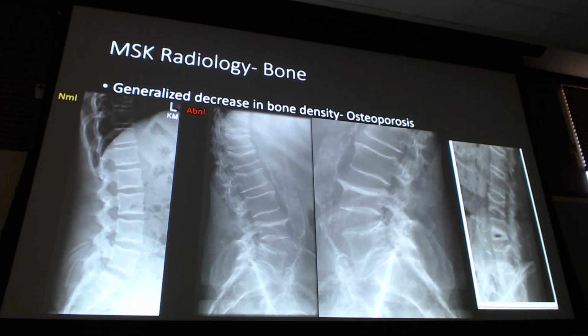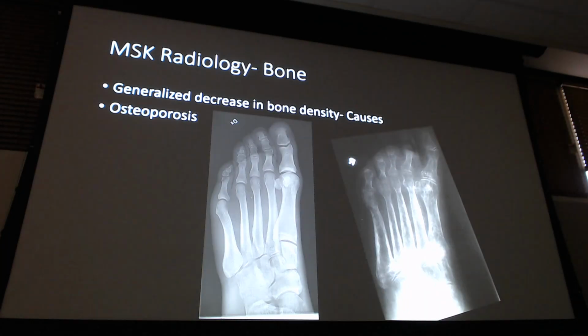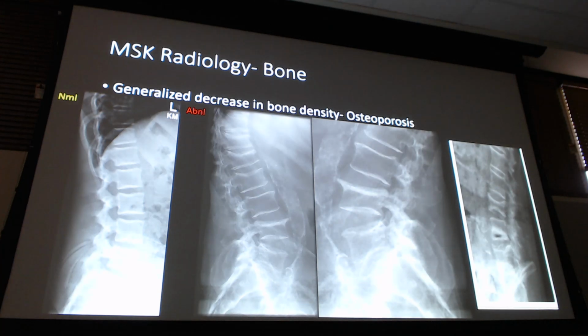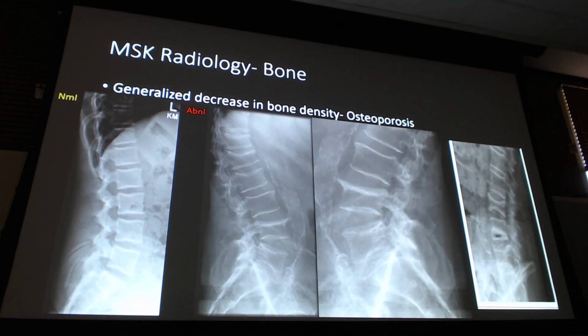So when I shoot an x-ray on a foot, I have a very thin area to go through, right? So that cortex and stuff is gonna pop a little bit more compared to that medullary canal, because I have just this thin area of a foot to put the radiation into. When I do a lateral spine x-ray, I'm pumping radiation through all of this tissue. So more of that radiation is getting dispersed, more of that is getting absorbed, so you don't have as bright of a contrast in there because of the spine. Okay, so good question and good thought process there.